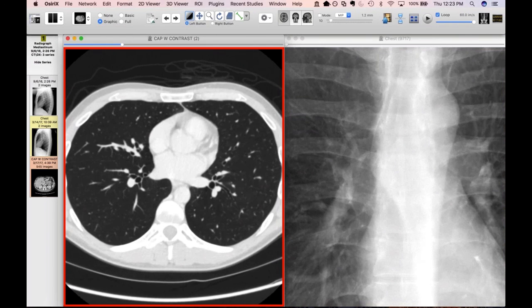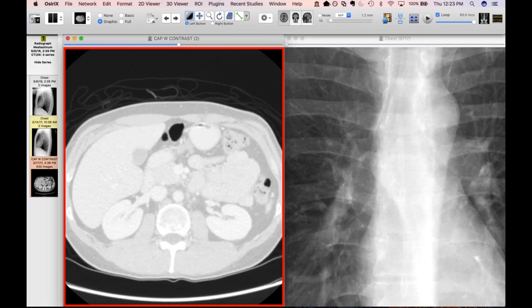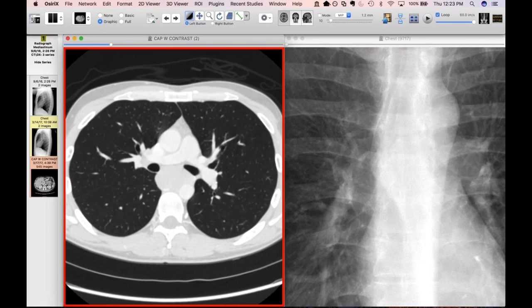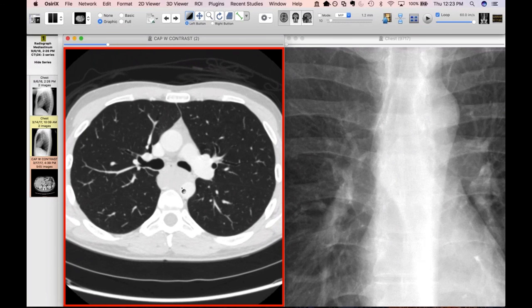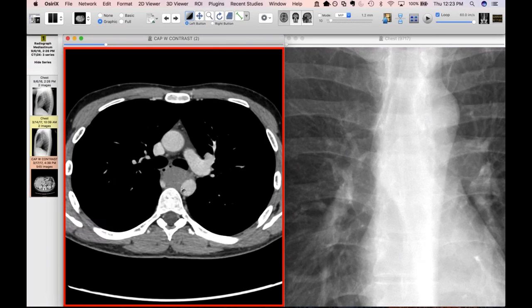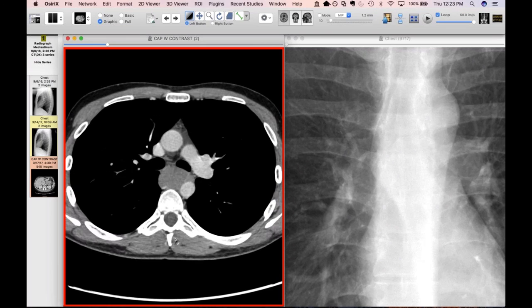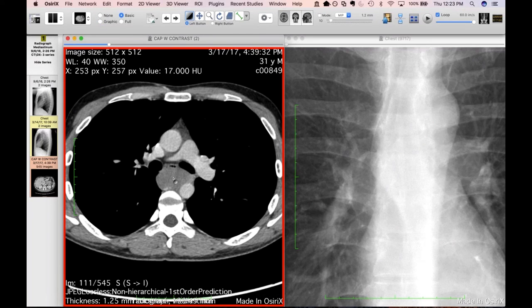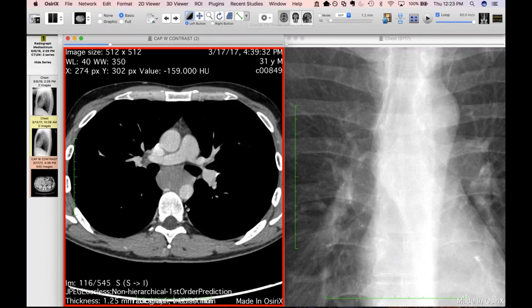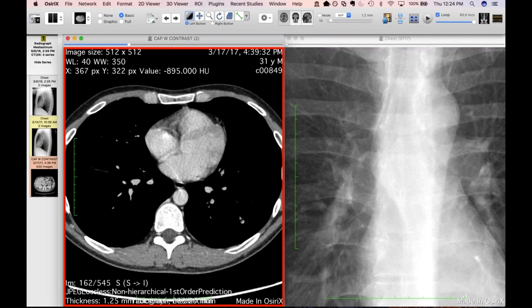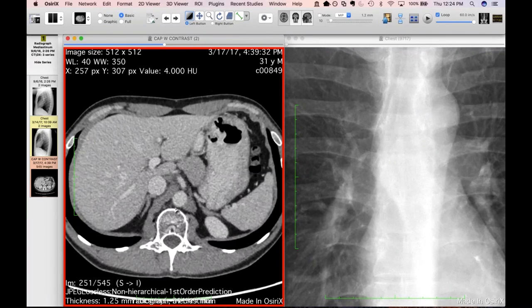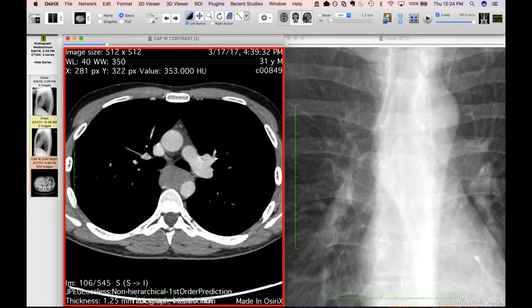Is it biopsy-proven, Travis? No — he's had prior retroperitoneal lymph nodes that are biopsy-proven and his tumor markers are going back up. So it's not proven yet, but there's a very high index of suspicion, and there was nothing here on a prior CT. I thought it might be a bronchogenic cyst, but it wasn't there before, and it looks kind of low in attenuation. It measures 40-70 Hounsfield units in some areas, so it's not a cyst. When I looked at the radiograph, I went back and looked at his CT and saw that he had some retroperitoneal lymphadenopathy, which increased my pretest probability that this was going to be a real finding.